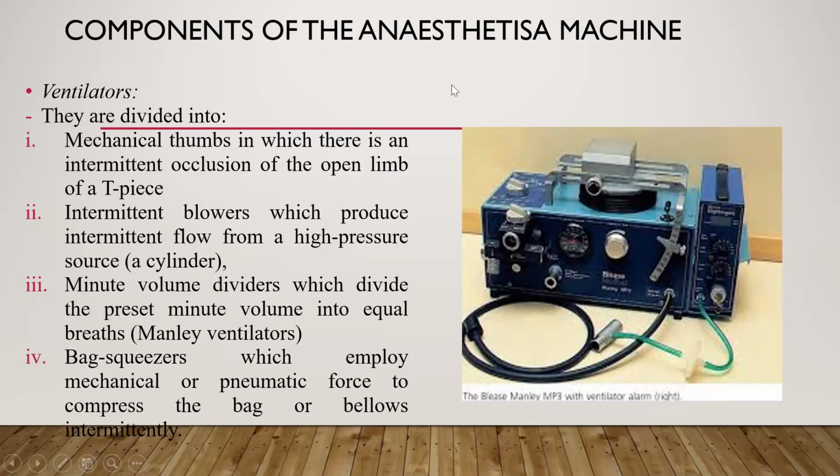Any other person, you have these Manley ventilators in your center? During an OSCE, if I bring this ventilator for you and you can't recognize it, you will fail. You have never seen a Manley ventilator before? No, sir. Hey, Prof, we are seeing it today. God save you, I'm not in your center. I would have deliberately brought this out.